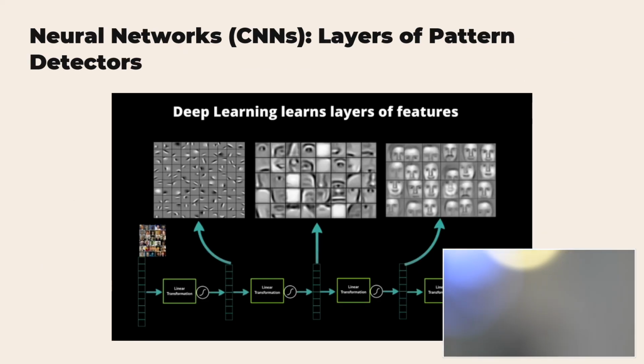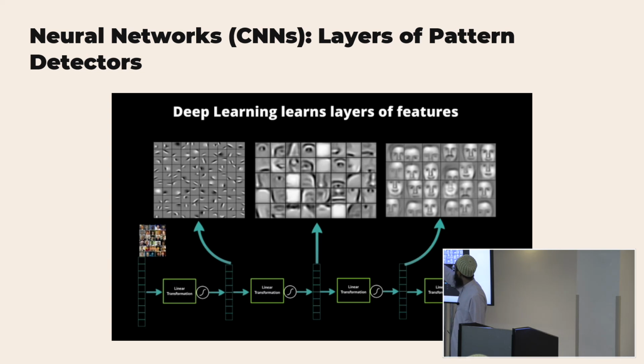And so kind of just to explain a little bit more visually what that is, this is facial recognition. And so when a neural network is learning how to do facial recognition, it'll just start with basic lines and shapes. And then as further and further down the neural net it goes, you can start to make out a few features. Maybe this is a mouth, maybe this is an eye, and then you kind of get closer to what looks like a face.